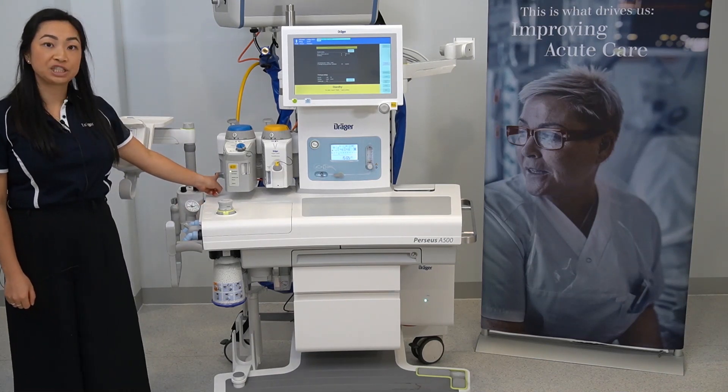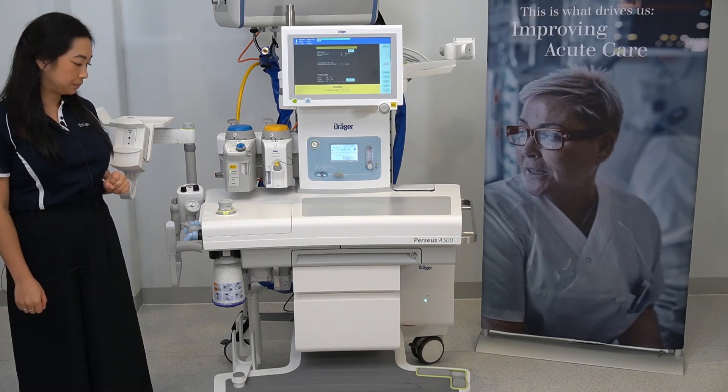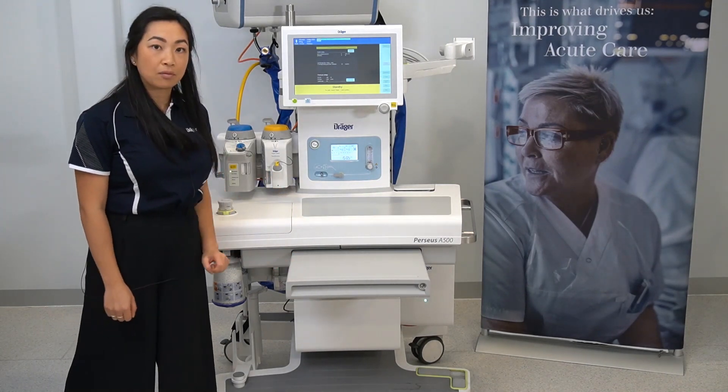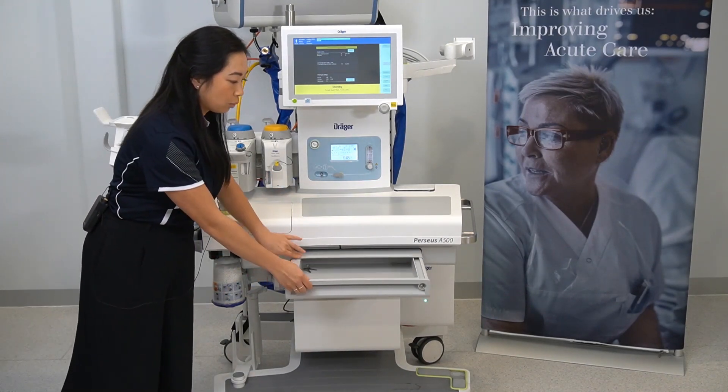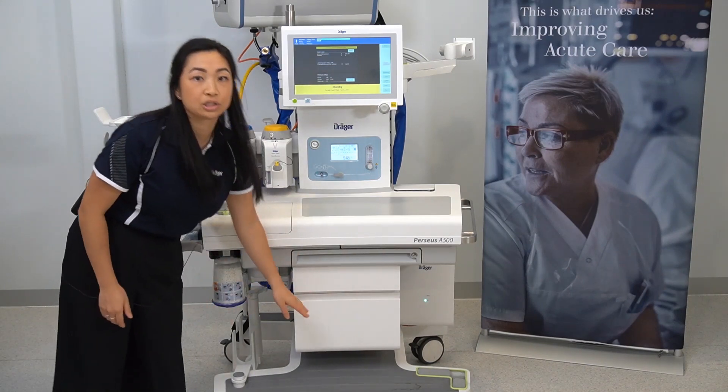The external fresh gas outlet is located to the side of the vaporizers. Here is a pull-out writing tray with a retractable lid and two storage drawers underneath.